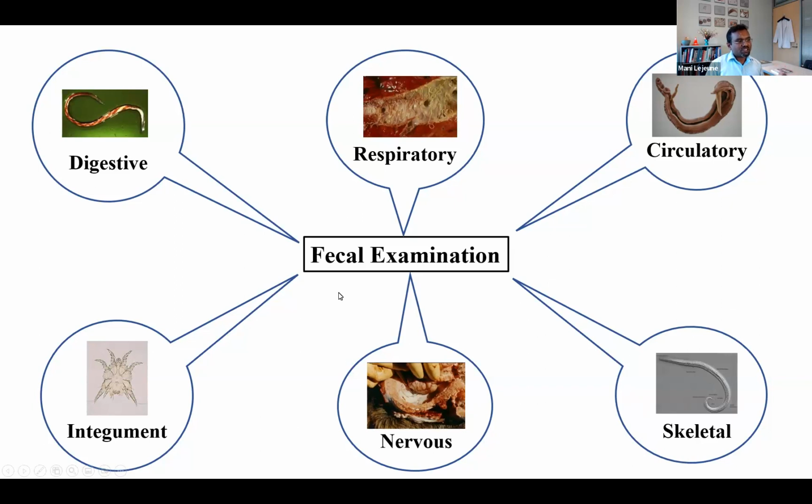So the idea here, or the take-home message, is that fecal examination can be done, and you are able to find parasites that are present or have predilection to different organ systems, and you can detect that and make a diagnosis.